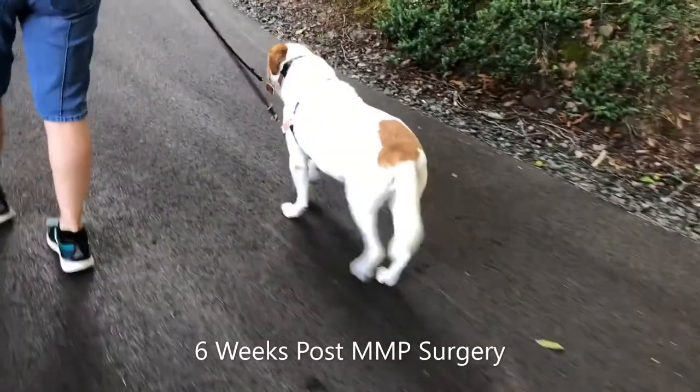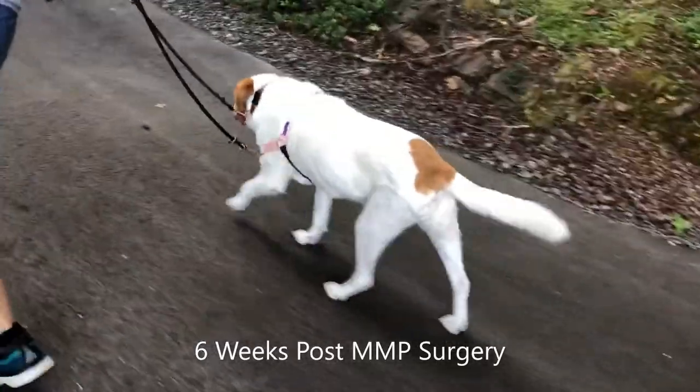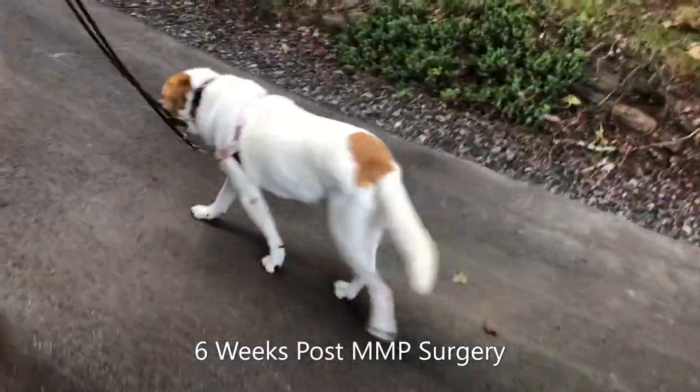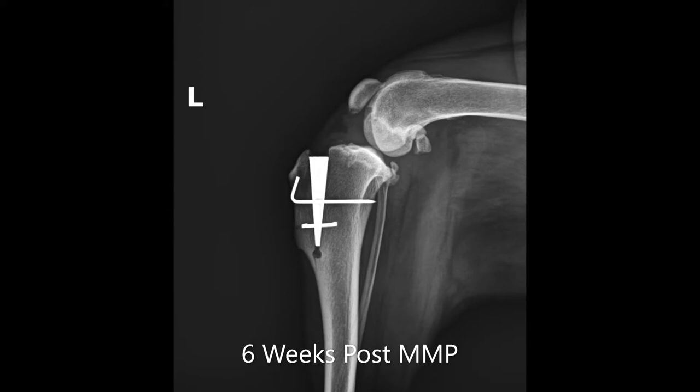At six weeks post-surgery, our patient is not quite back to normal, but continues to improve. At a six-week follow-up appointment, a radiograph is taken to assess the stifle joint and the MMP implants. As seen here, all implants are stable and the bone is healing well, so our patient will be given the go-ahead to increase exercise and start moderate off-leash exercise.